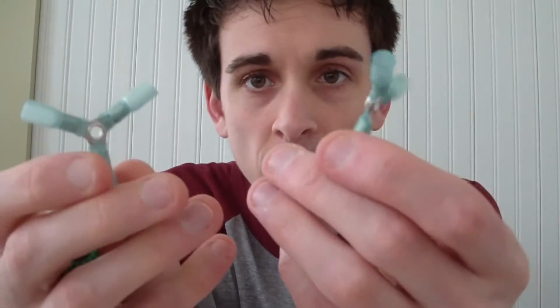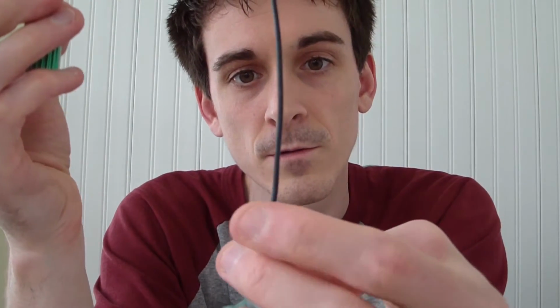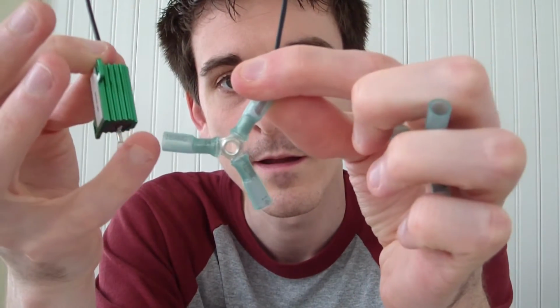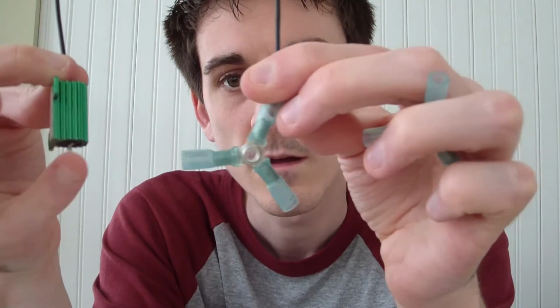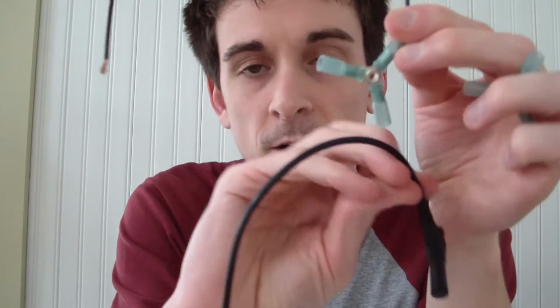Well, the way I do it doesn't have to be the way everyone does it. I use a 3-way wire connector. So what I'll do is, trying to hold this up like this, one wire is connected to the other wire in the wire connector like so, and then the positive goes to my source. This wire goes to the source, and the other wire, the part that goes in the multimeter, goes into the multimeter.